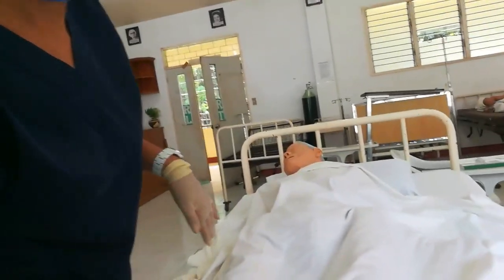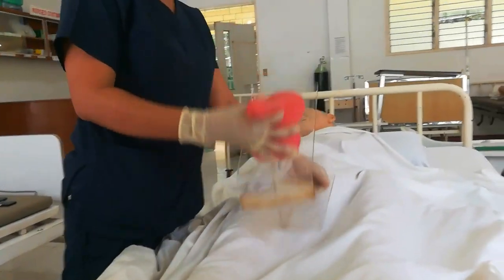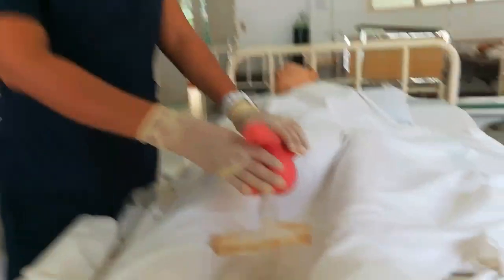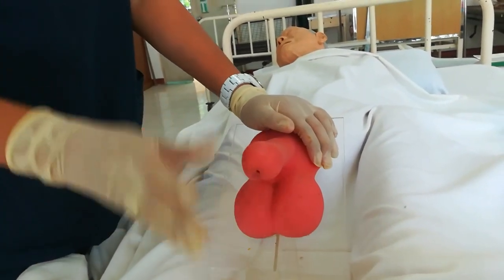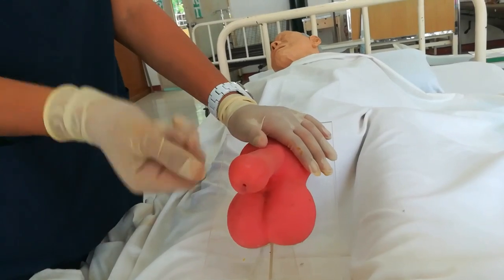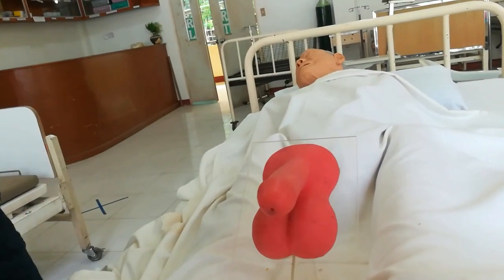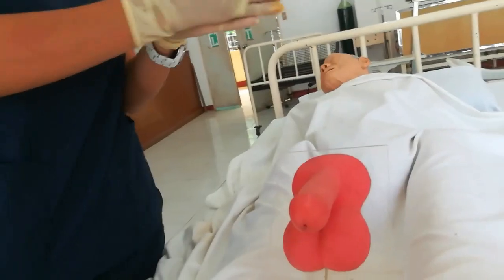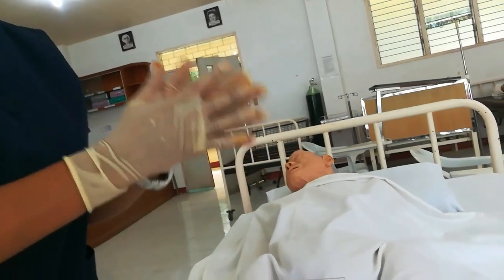For the male perineal douche, the same procedure applies from steps 1 to 11 as for the female perineal douche preparation. In cleansing, with your non-dominant hand, firmly hold the penis in an upright position.